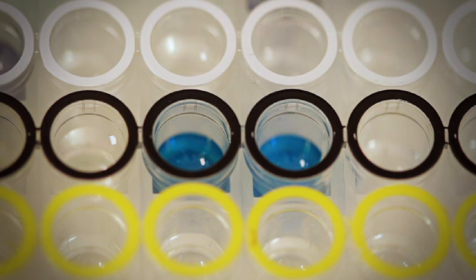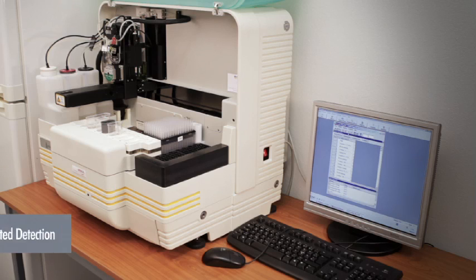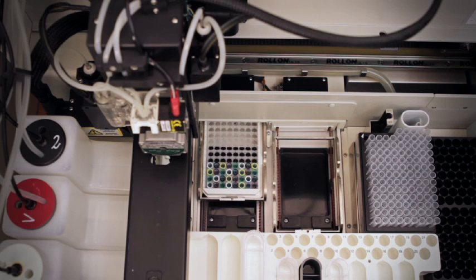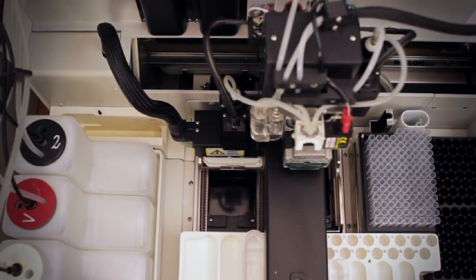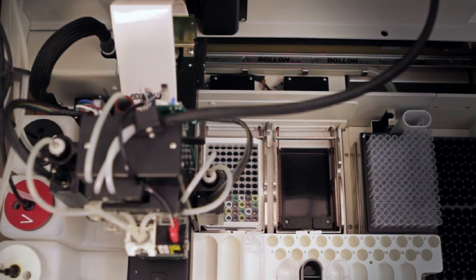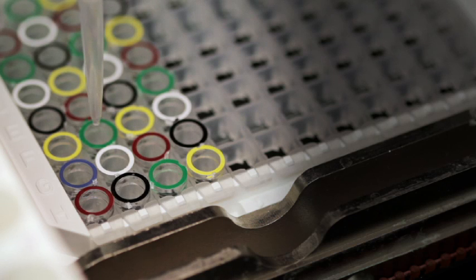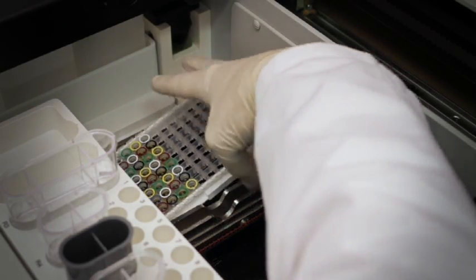The measurement works with a common plate reader. For your convenience, you also have the option of automated detection — put the prepared, sample-loaded plate into the processor and start the HyPlex detection program for automated hybridization. Finally, print the results for your documentation.